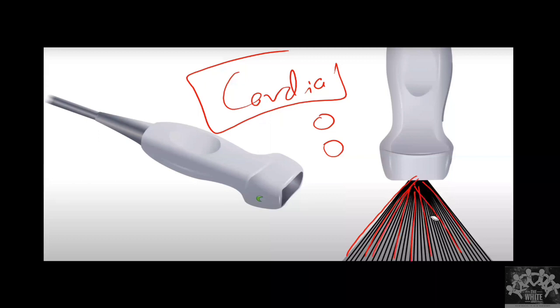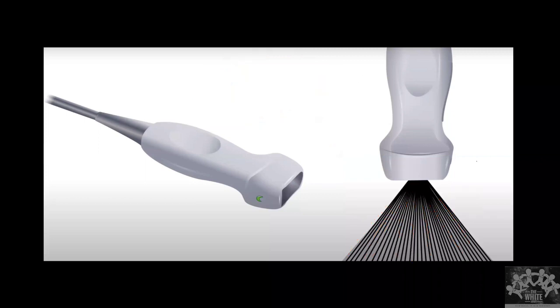So these are the different probes that we use. The phased array is not important for us, but we need to know how to use a linear probe, a curvilinear probe and a transvaginal probe. We need to know when to decide that.